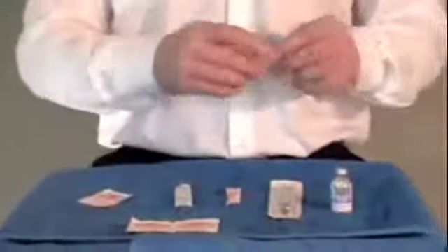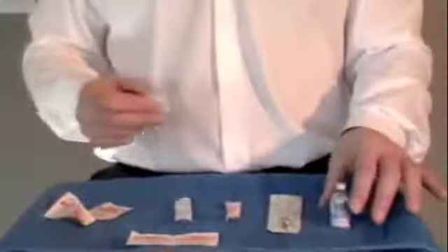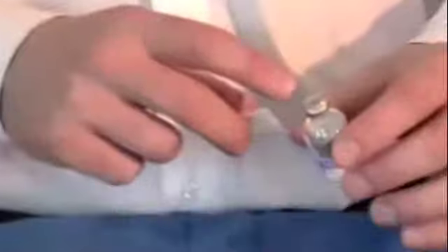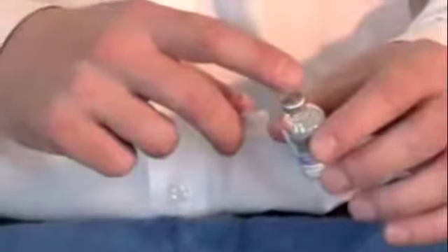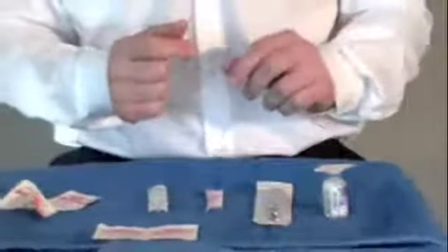The first step is to cleanse the testosterone. We will take a single alcohol swab. When you initially get your vial of testosterone, it's likely to have a metallic covering over top of the rubber hub. After you remove that, you'll see the rubber port. You can cleanse that with the alcohol. I usually let the alcohol swab just sit on top of the testosterone to keep that sterile.